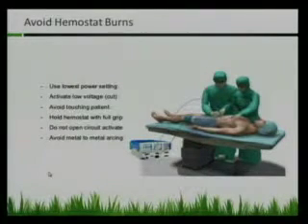They're still going to do it. I think it's just so ingrained in the procedure and how we do things, but it's not an issue. You're going to seek the ground as long as you have the grounding pad on. I think in bipolar, it could potentially be an issue if you don't have a grounding pad on and for some reason you had stray energy. But in monopolar, where you have a big circuit and you have the pad on, those things are not an issue. Pacemakers, all that stuff.